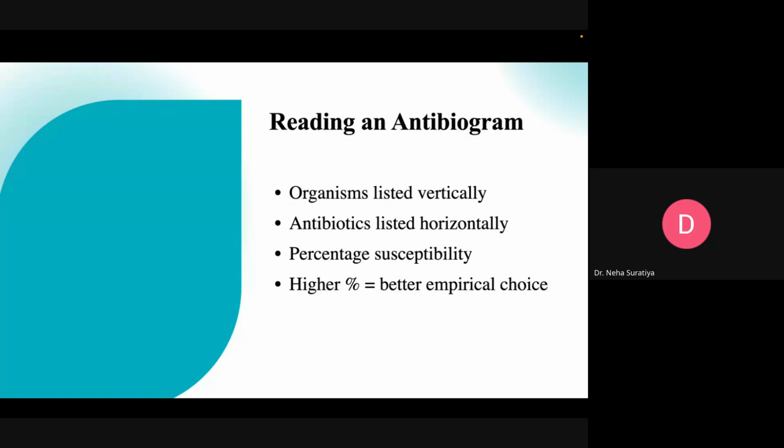This means out of 100 E. coli isolates, 85 were sensitive to amikacin. 85% केसेस ऑफ E. coli में आप अगर amikacin ट्रीटमेंट दोगे तो वो वर्क करेगा. सेंसिटिविटी मीन्स it will be, yes, you can go with it. But 85% shows that amikacin is an empirical choice, ठीक है, broad spectrum antibiotic choice है. So how much percentage of reliability will be there? कितना परसेंटेज मैं उसके ऊपर ट्रस्ट कर सकता हूँ, ये आपको एंटीबायोग्राम दिखाता है. ठीक है, I hope it is clear to you.